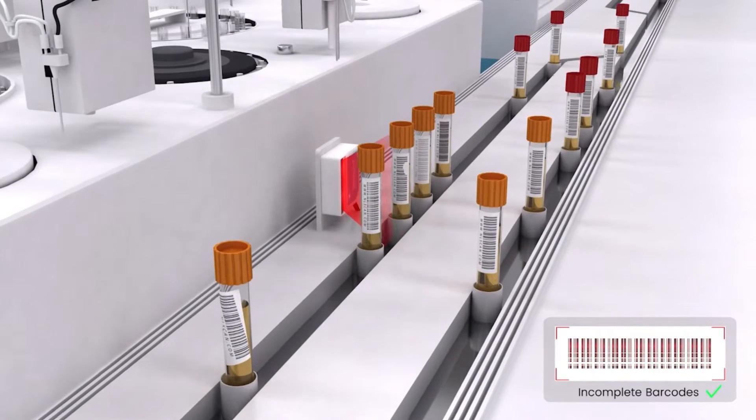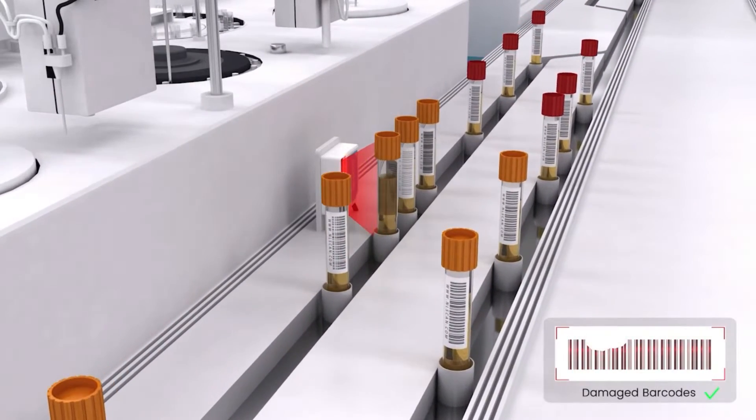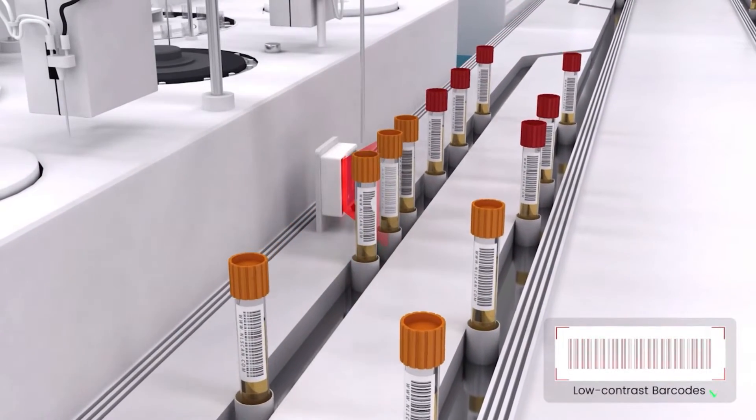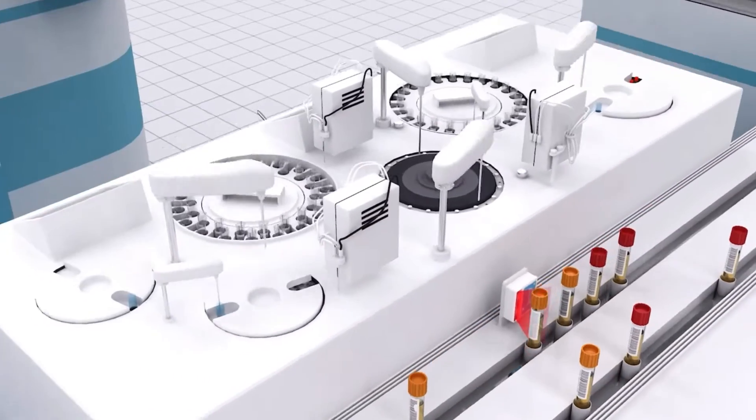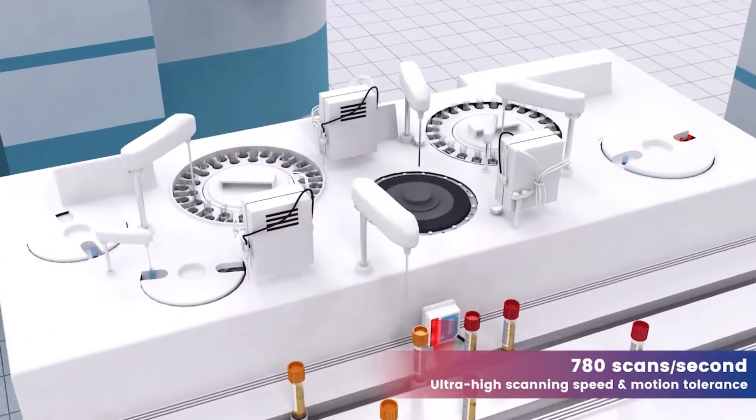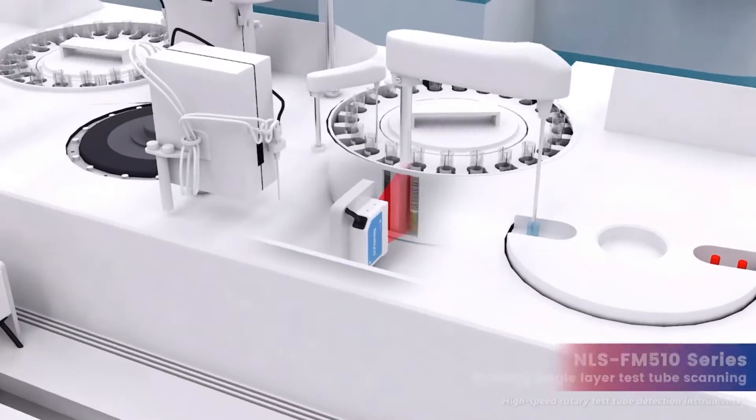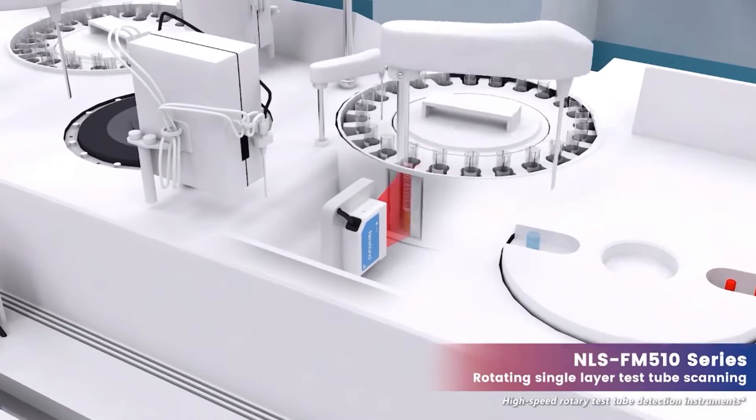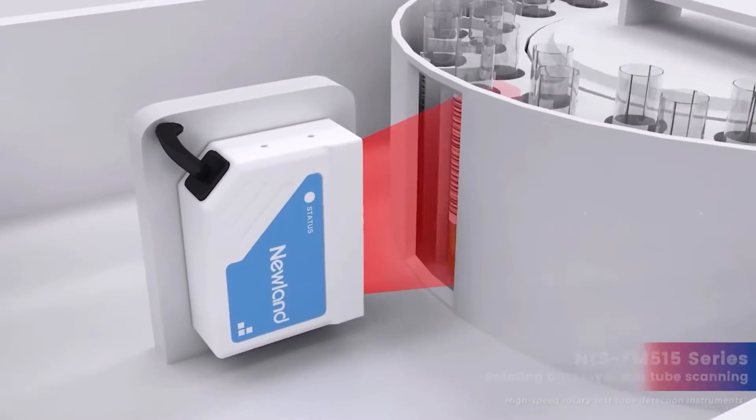Thanks to the robust decoding algorithm, the scanners avoid decoding errors or partial data capture. The decoding rate of up to 780 scans per second allows for reading fast-moving barcodes on high-speed rotary detection instruments.